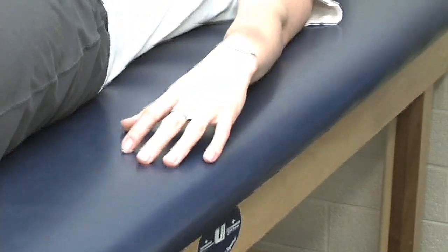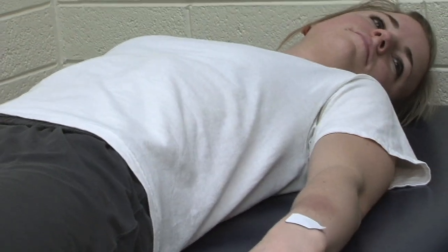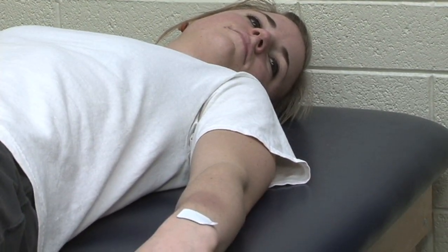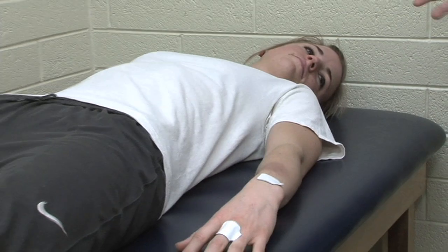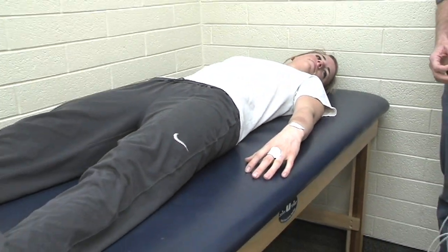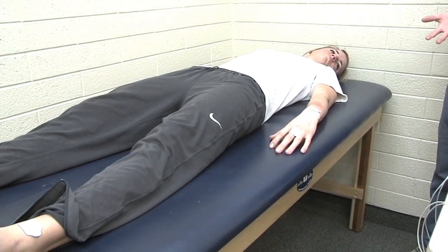Client positioning is very important. This method assumes that we're a series of cylinders — one cylinder for each leg, one cylinder for each arm, and a cylinder for the trunk. So it's important to keep those cylinders separate; you don't want the client having any body parts touching. She's in a good position right now. We also want to make sure that she's not wearing any metal, because metal is a good conductor.